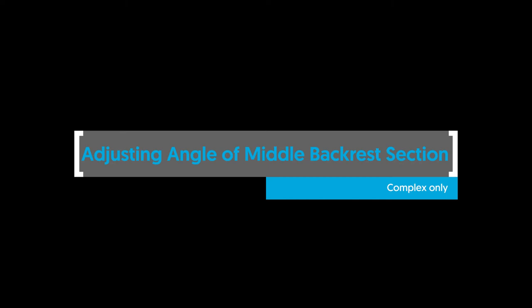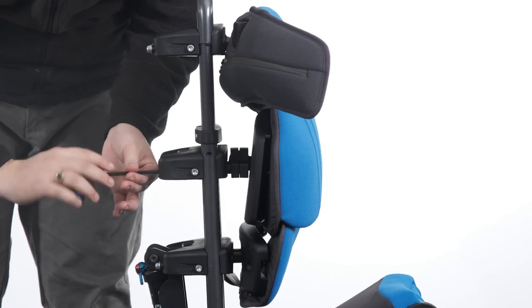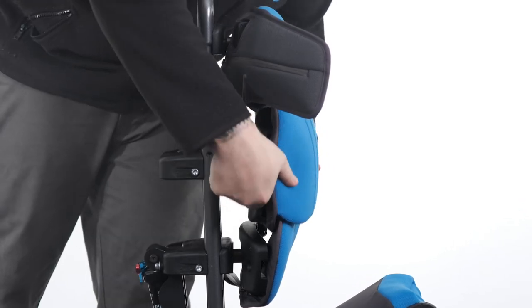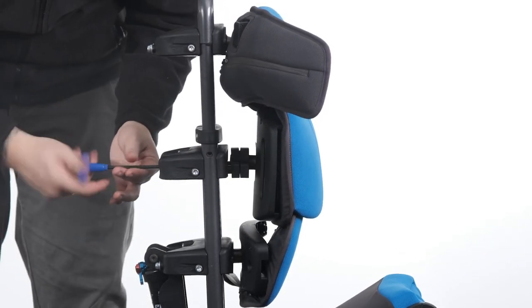Adjusting angle of middle backrest section — complex only. To adjust the angle of the complex clamp, loosen the bolts of the clamp. Adjust the angle by rotating the backrest section in all axes to the desired position. Tighten the bolts to secure in position.